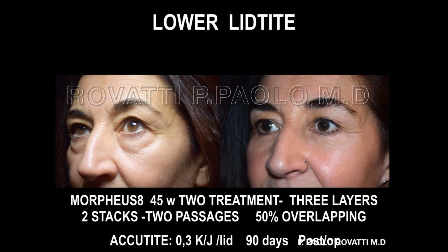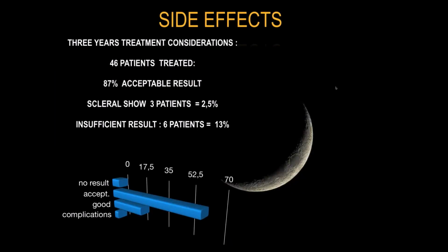So that's not an indication for you, but sometimes you can do it if they don't want a scar or a more invasive treatment. Don't promise too much. So this is my consideration after a few years: 46 patients treated, 87% have acceptable results. I have only 3 patients with scleral show, which is 2.5%. Insufficient results in 6 patients, but if it's insufficient, you can treat again after 6 months.